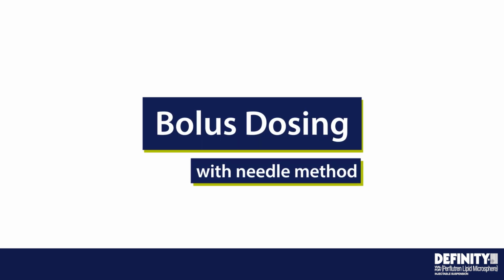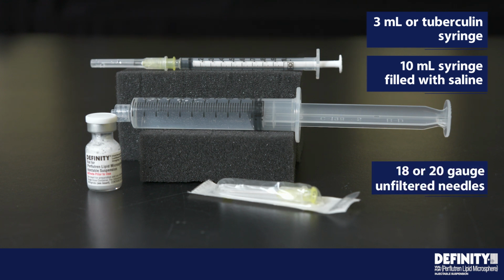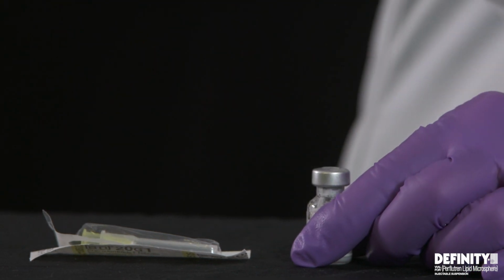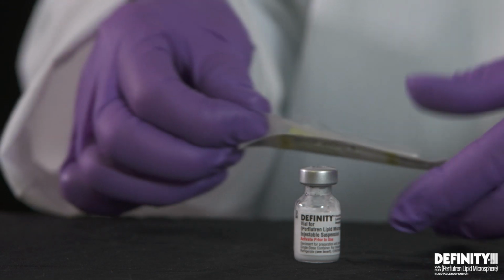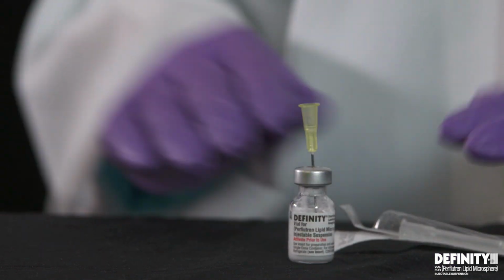Bolus dosing with needle method. Supplies needed include a 3 milliliter or tuberculin syringe, a 10 milliliter syringe filled with saline, and 18 or 20 gauge unfiltered needles and a stopcock, which is optional. Following activation with vial mix, remove the cap from the DEFINITY vial. Vent the vial with a needle by placing the needle tip in the activated DEFINITY vial.